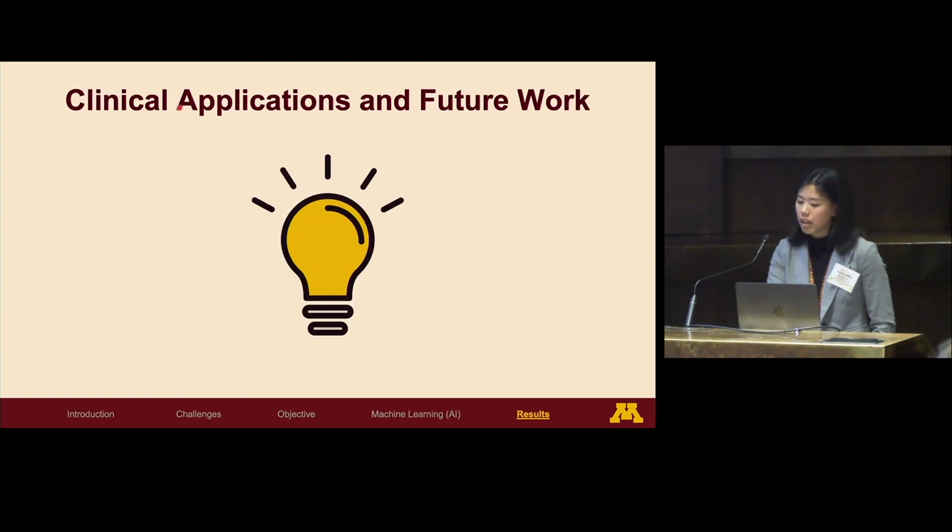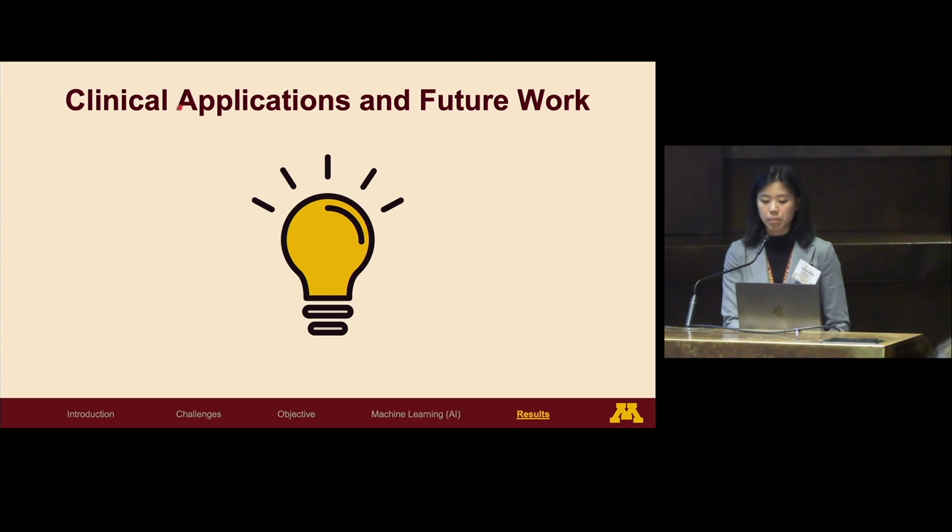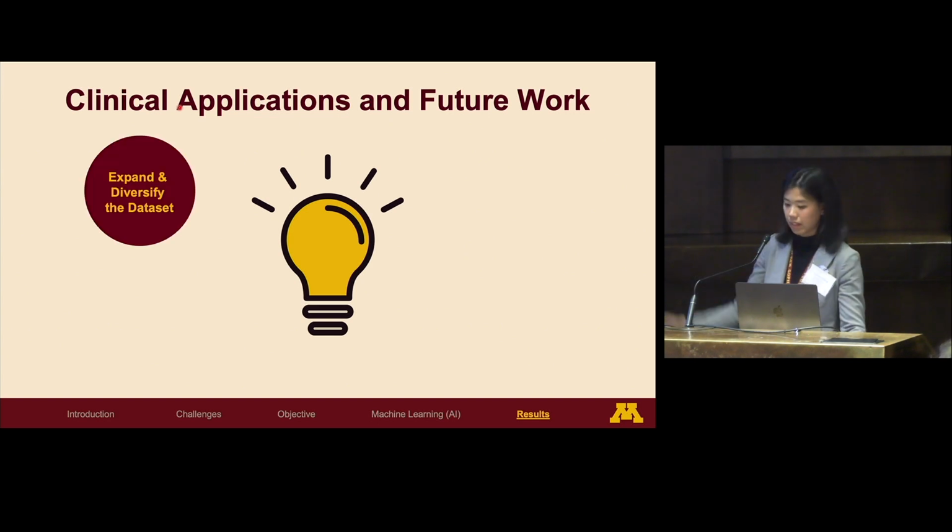So this model has great potential to assist clinicians by providing fast, consistent, and accurate segmentation of chronic subdural hematoma, supporting diagnosis and treatment planning. There are several ways that we seek to improve the model and make it better suited for clinical practice. The first will be increasing the data size from multiple institutions to improve model generalizability.